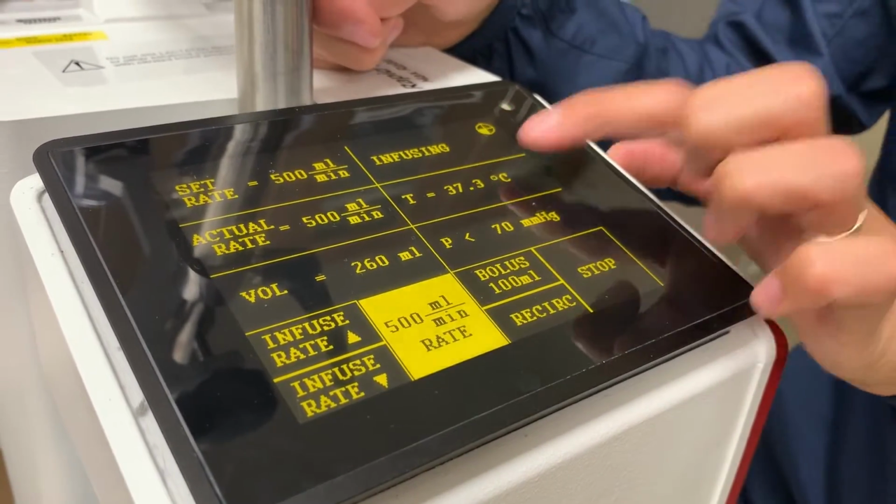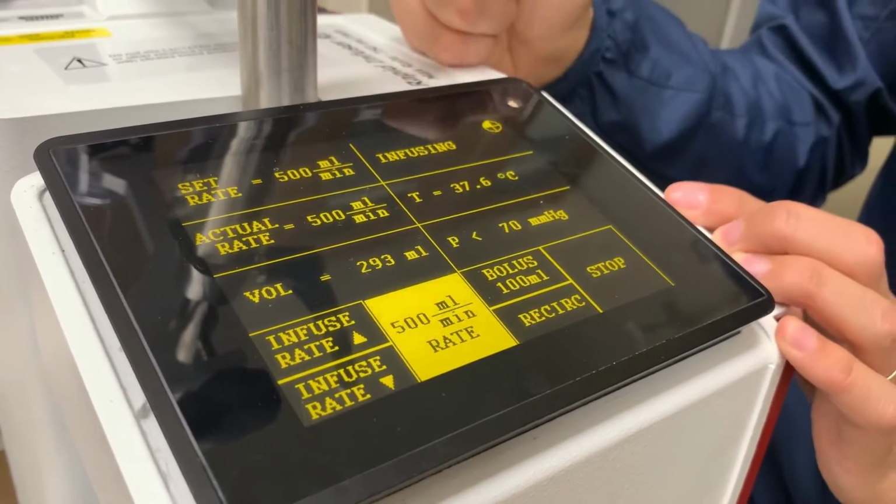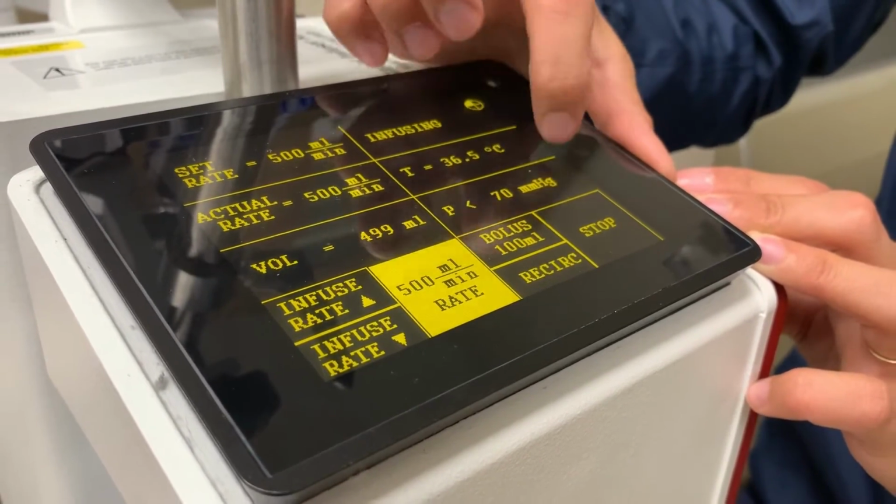This is telling you the temperature of the fluids. And this is saying that it's infusing. So the P is just telling you the pressure.